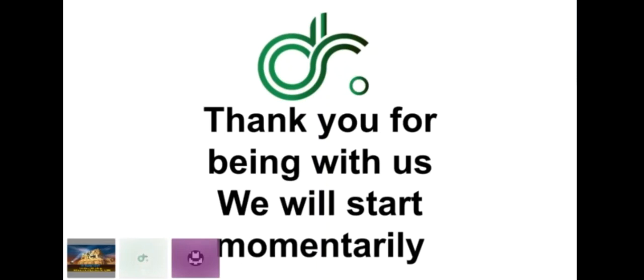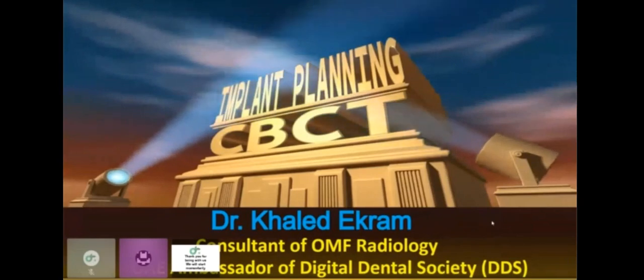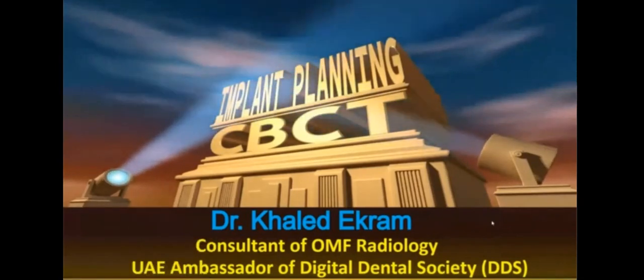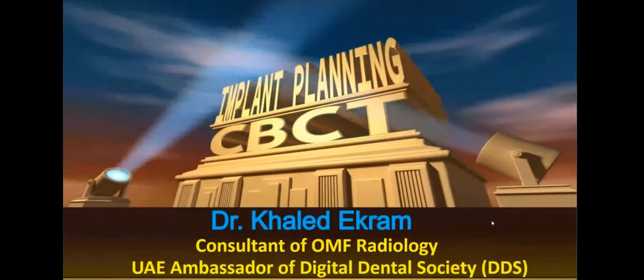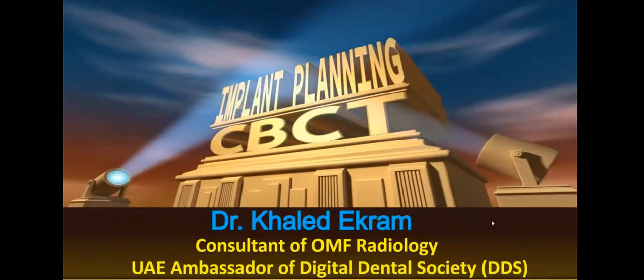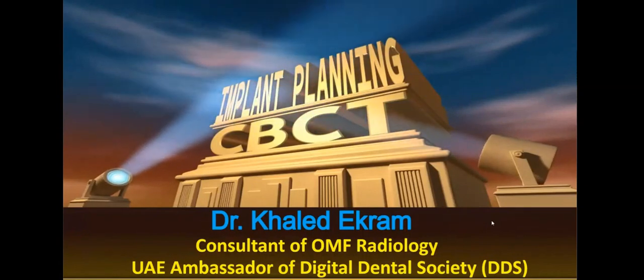Our topic today is implant planning using the CBCT. The first half of the lecture, in about 30 to 40 minutes, I will be your speaker. My name is Dr. Khalid Ekram, and the rest of the lecture will be by Dr. Amr Ekram, my colleague. He's going to also continue the lecture.